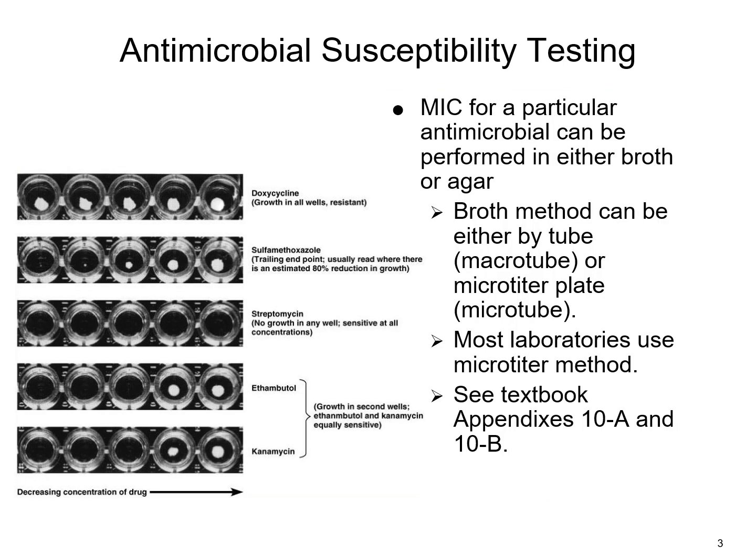And then there's a broth testing method. We've seen the strip test, we've seen the disc test, and then there's a broth method in which the broths are diluted out. Depending on what the dilution is, it could be 1 to 2, 1 to 4. Of course, these aren't it, but you get an idea. It keeps going, but these are probably a lot different than this.